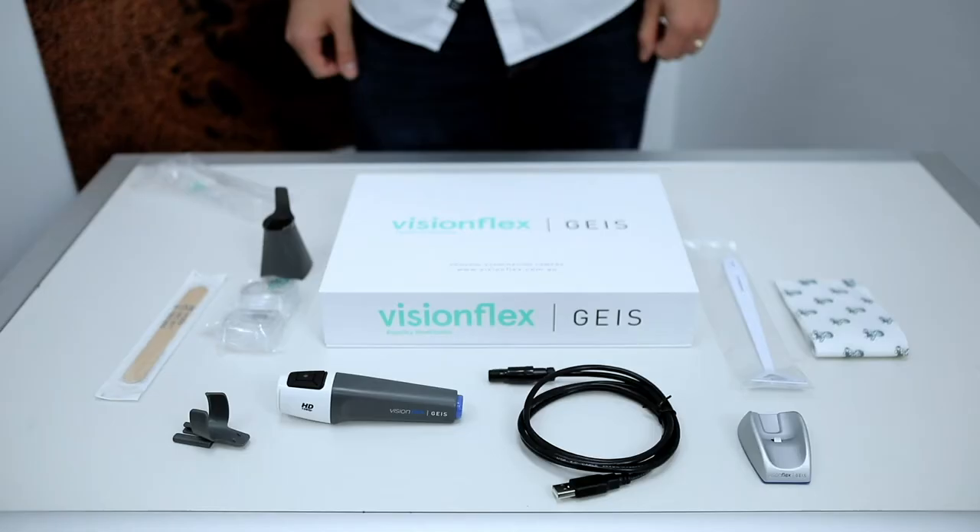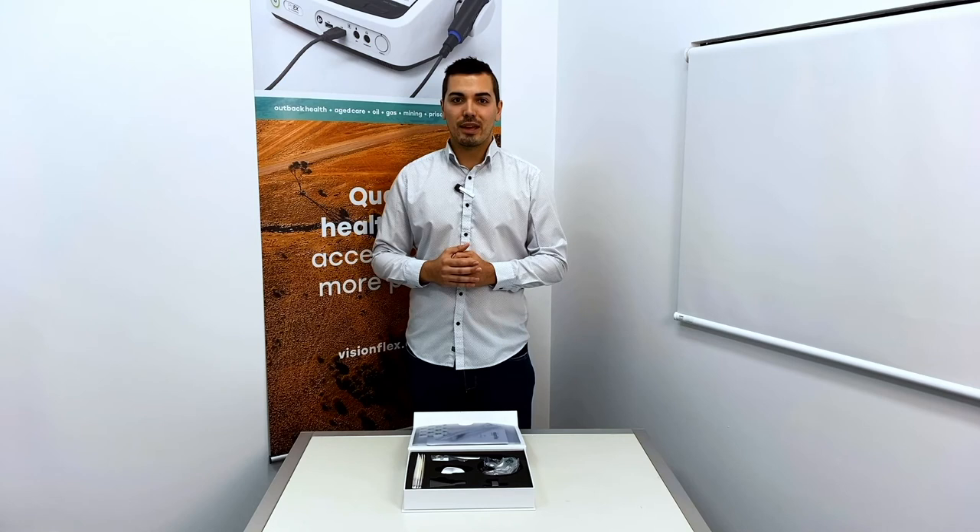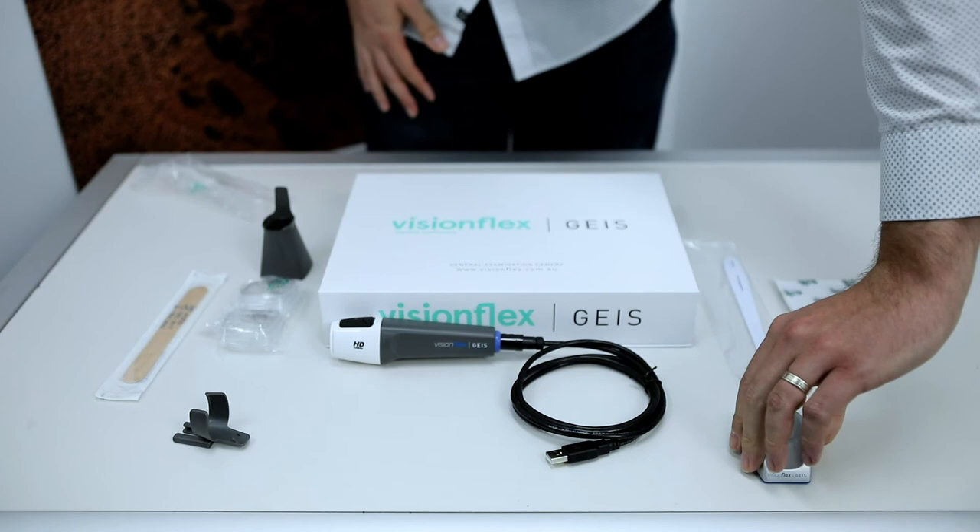To get started, remove your GEIS camera and the supplied USB cable. Connect the cable to the back of your GEIS camera. You're now ready to connect the GEIS to your ProEX, PC or Mac computer.